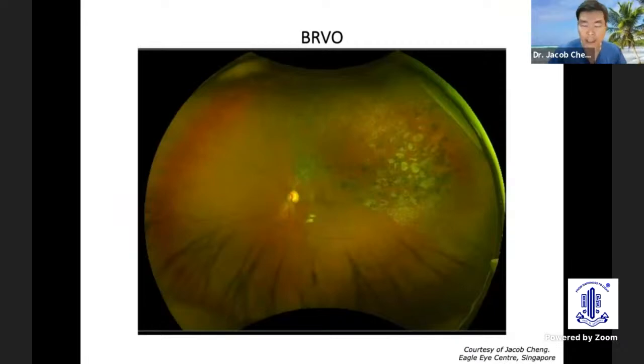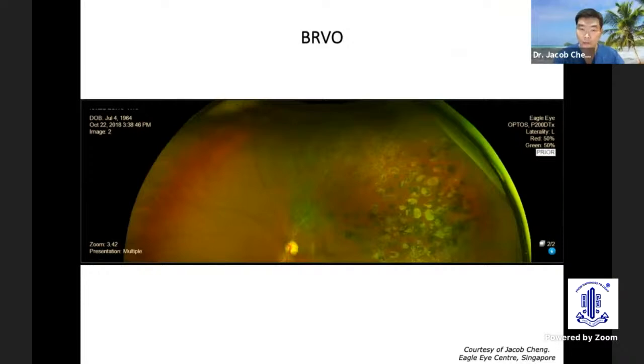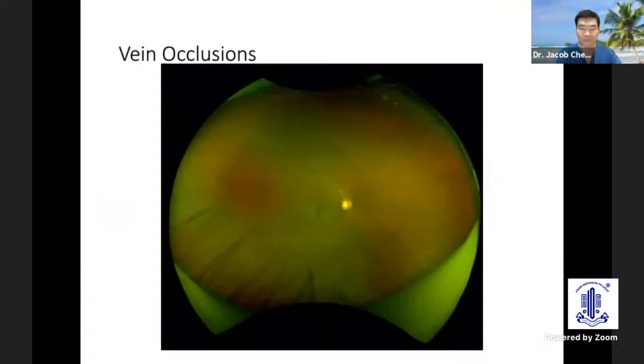A patient presented symptomatically with blurring of vision, found to have branch retinal vein occlusion on the superior temporal aspect of the left eye, successfully lasered, as you can see here. So this is a close-up view of the successful sectoral laser for this branch retinal vein occlusion, green channel showing the sclerosed vessels as well as the extent of the laser, both surrounding the sclerosed vessels as well as to the far periphery.